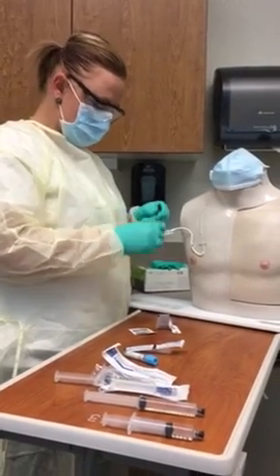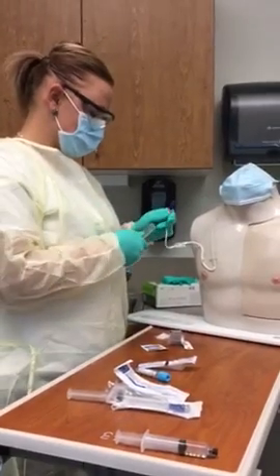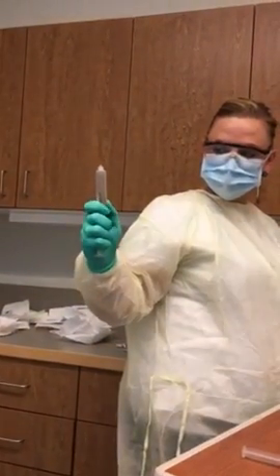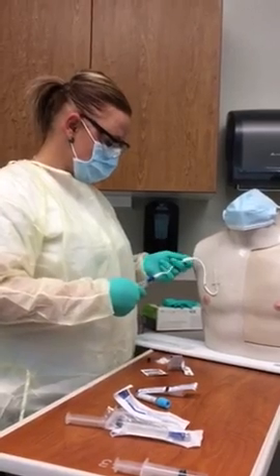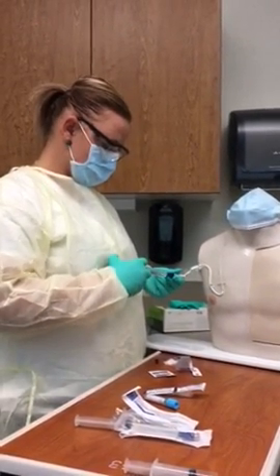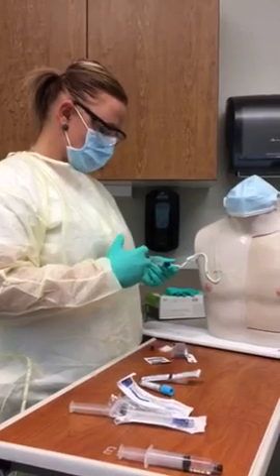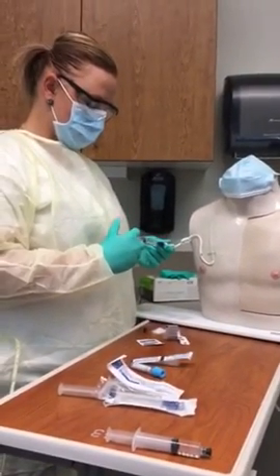Okay, once it's nice and clean, I'm going to take my first 10 cc syringe full of saline, make sure I get all the air out of it. Touch that there. Going to unclamp here. We're going to flush using the push pause method. And it flushes beautifully. Any problems or are you having any pain? No, not at all. Perfect.